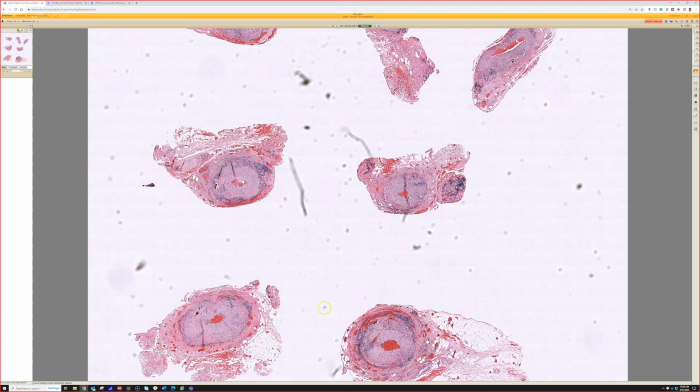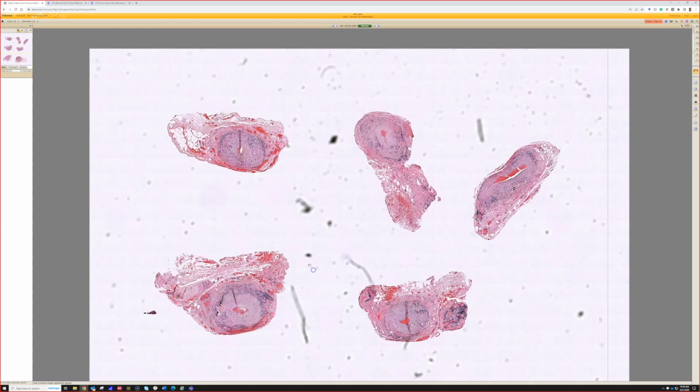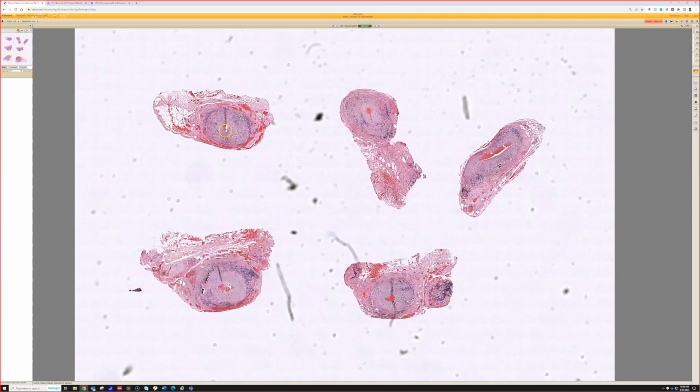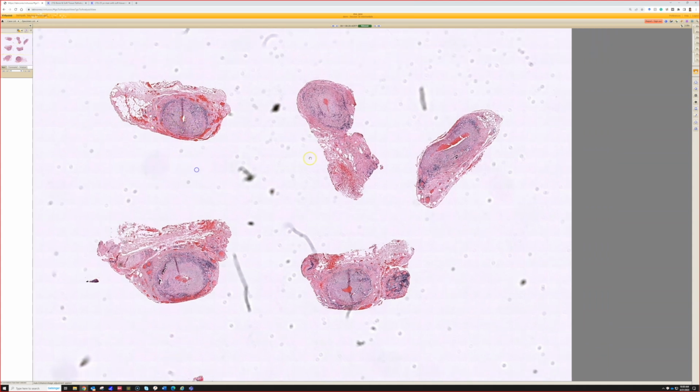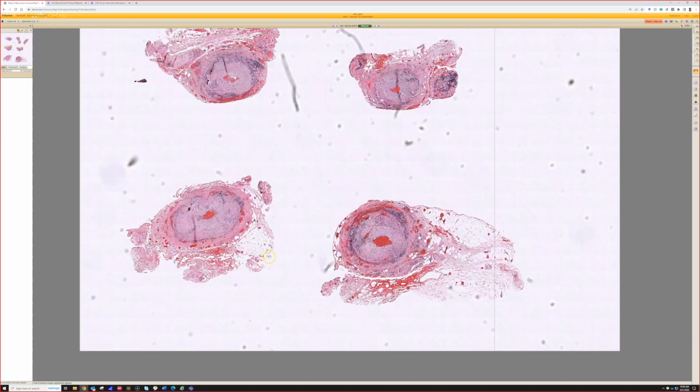We have a large muscular artery, just based on the context clues, probably going for temporal arteritis. It's the temporal artery. For anyone who's new watching this, we would never cut a specimen like this otherwise. When they send us a temporal artery biopsy, we cut it up in cross section and then embed it very carefully so you can see multiple cross sections in the same slide.